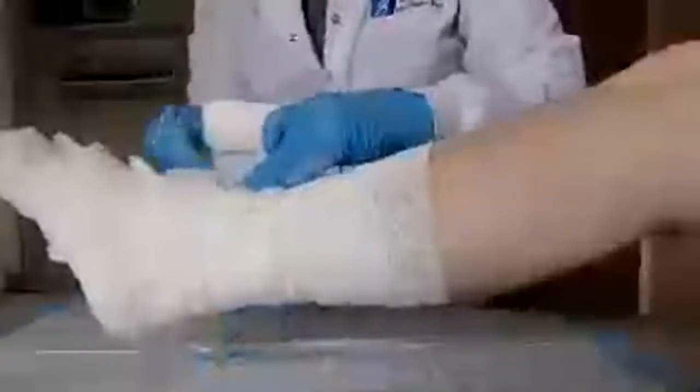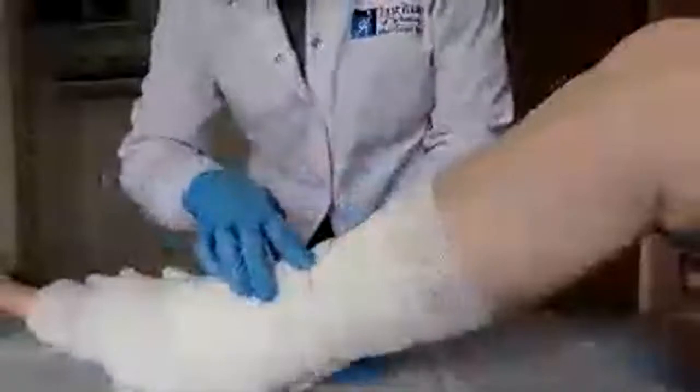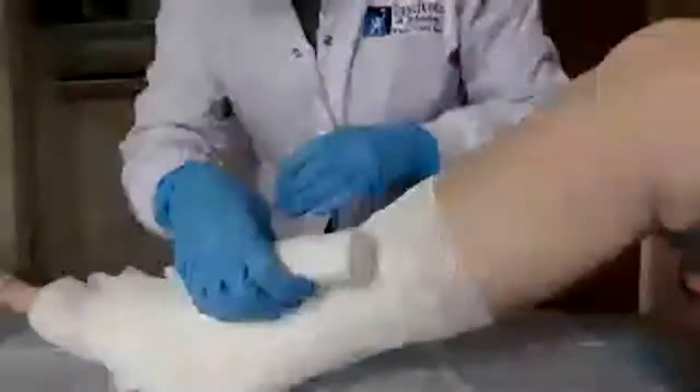So once again, we go back and forth. This, you oftentimes have to hold a little more. The zinc oxide kind of sticks to itself. This one is softer, and bouncy, so it wants to come off. So you zigzag back and forth. We're almost to the top.